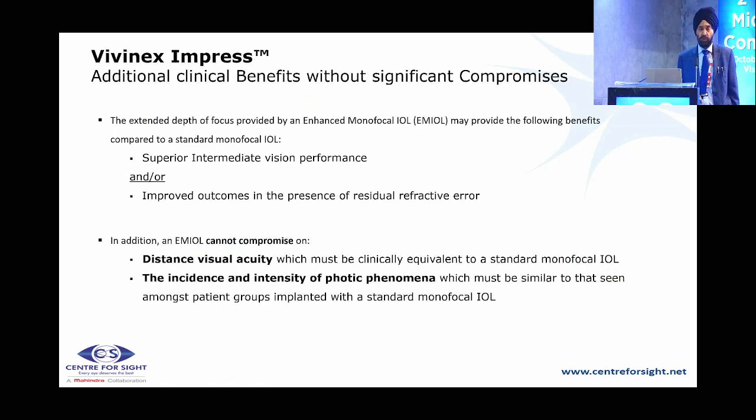You can push it through a 1.8 millimeter incision with a nozzle that goes forward as a wound-assisted technique, or you can go into the wound at 2.2 millimeter.